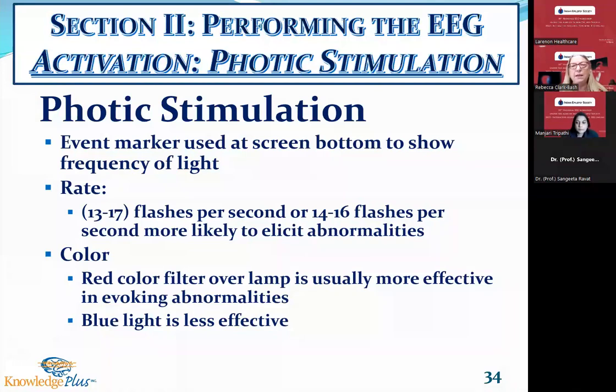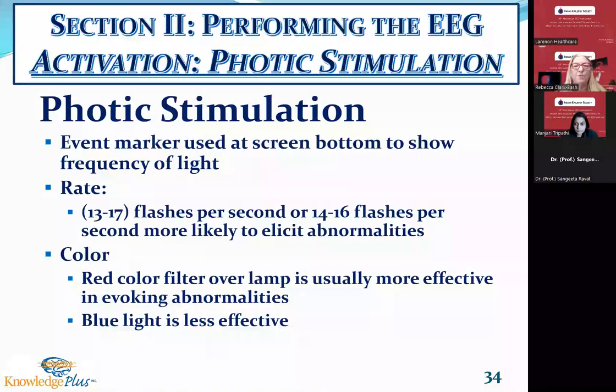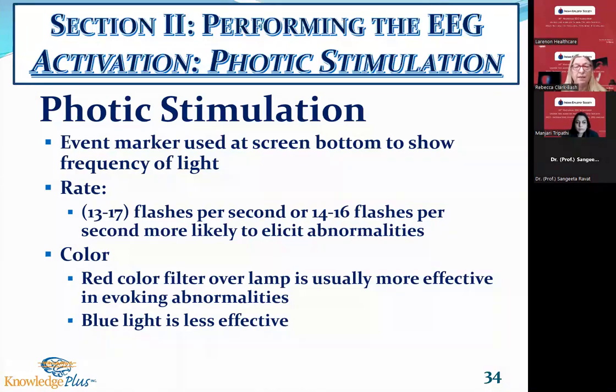Now, decades ago, we had color filters that went over the top of the photic light. So there was a red filter and a blue filter. After we got done doing photic stimulation with the white flashing light, then we would put the red filter over. And again, that would be more apt to elicit an epileptiform abnormality. Blue light was less effective.